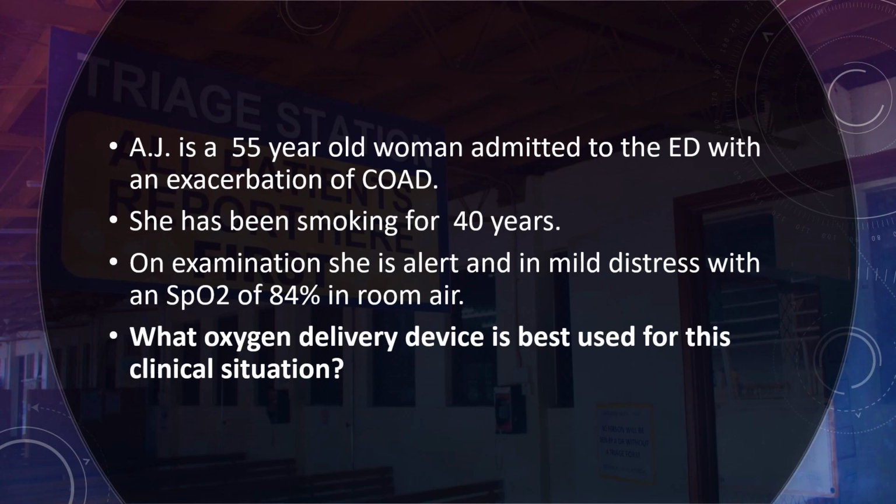AJ is a 55-year-old woman admitted to the ED with an exacerbation of COAD. She has been smoking for 40 years. On examination, she is alert and in mild distress with an SpO2 of 84% in room air. What oxygen delivery device is best used for this clinical situation?